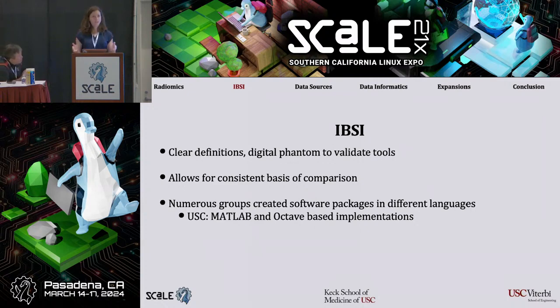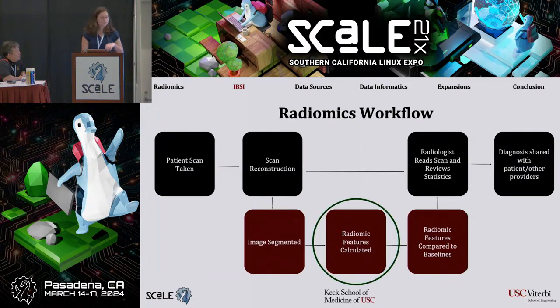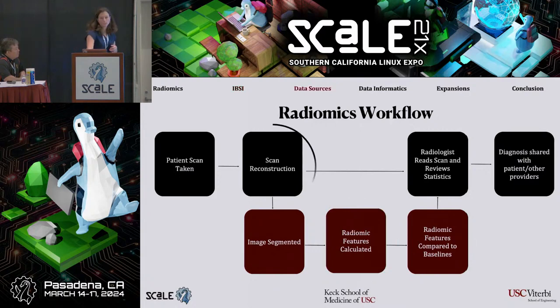IBSI was the set of definitions that was set out in 2020, and since then there have been Python-based approaches, and other MATLAB approaches. Our lab came up with a MATLAB and Octave-based implementation, and we're releasing that to the public for greater adoption of this set of statistics. So after generating this tool and validating it with the digital phantom, or the mock-up image, making sure that our processing algorithm was accurate, we wanted to levy this tool to better clarify our workflow. So especially since we're working in a CT lab, something we wanted to look into was the scan reconstruction.